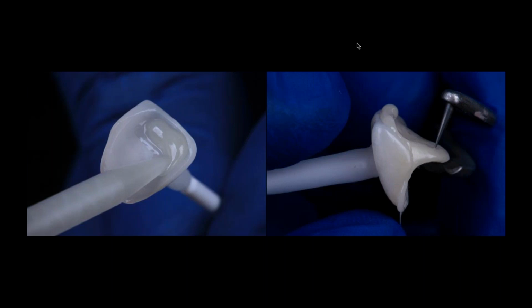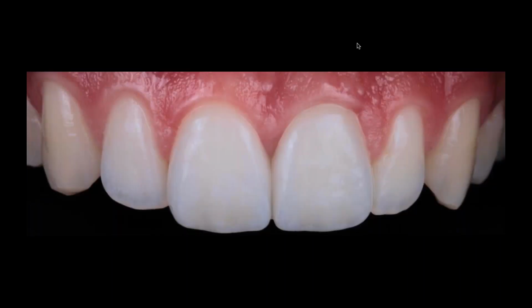And the photo on the right is a very nice photo because we want to make sure that every time we deliver a restoration in the patient's mouth, when we bond to a tooth, we want to make sure to see excess of cement flowing around 360 degrees following the margin to assure that that interface is as sealed as possible. Sometimes we think that no cement or less cement is better, but we really want to have that margin as sealed as possible. So you can see here a very nice aesthetic outcome. These are VITA Trilux Forte veneers, one bonded to the tooth and one bonded extraorally to this custom zirconia coping.